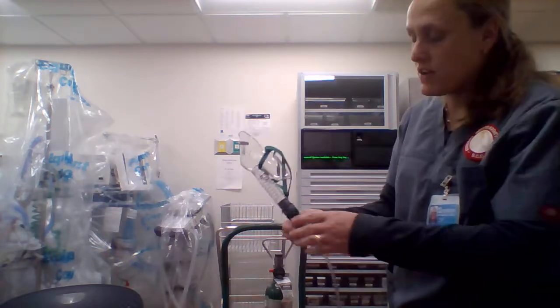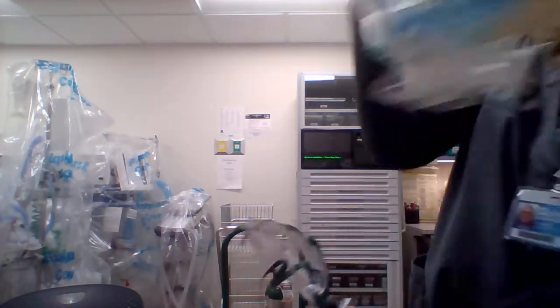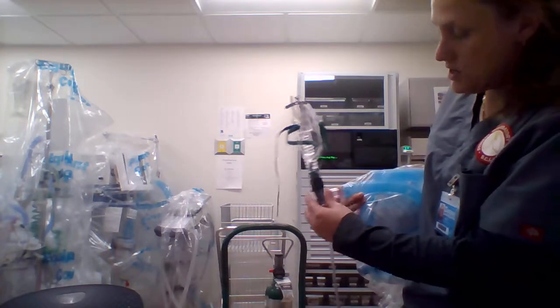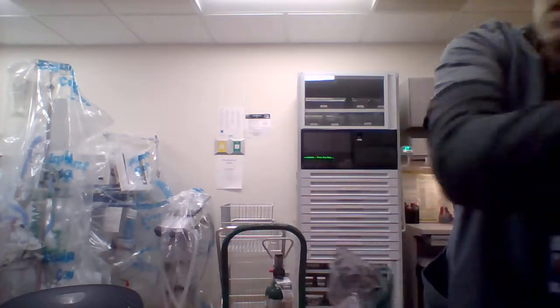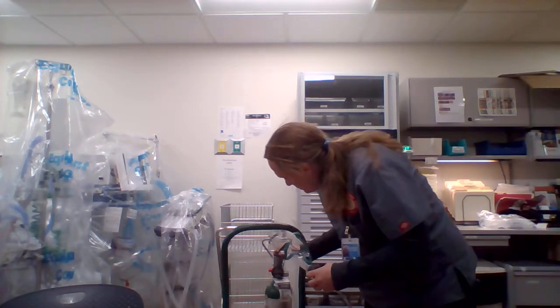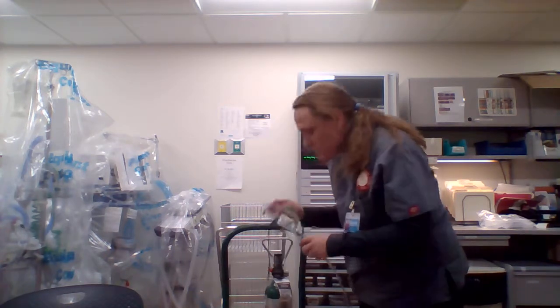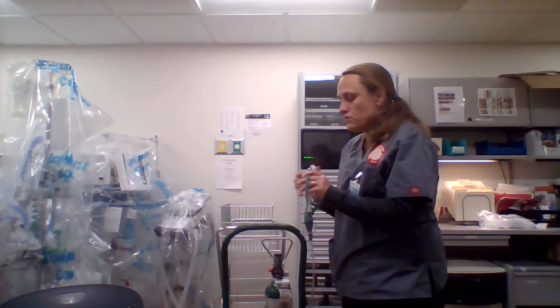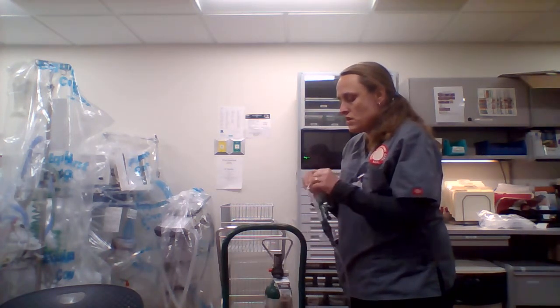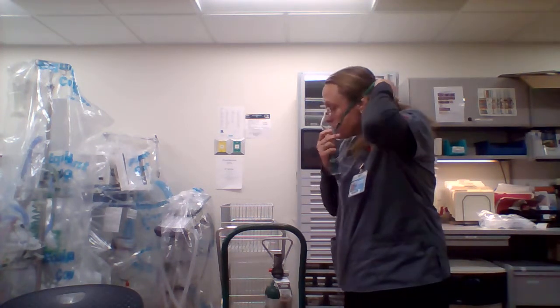Here's a way to add humidification. You would have the larger tubing, such as this, and hook it here, and then you can add humidification to it. I can hear it, so I know it's on. It's really deformed. It also goes over the patient's head.